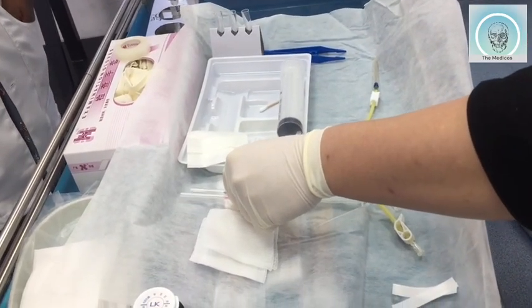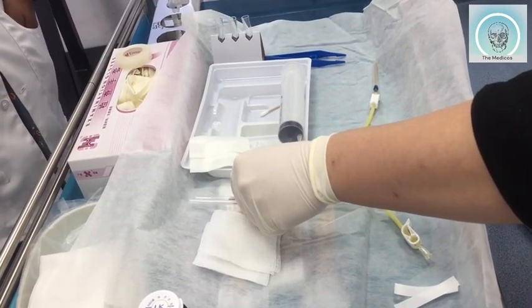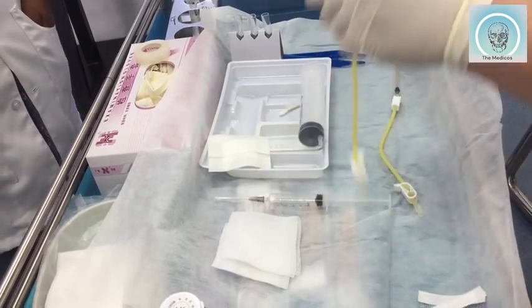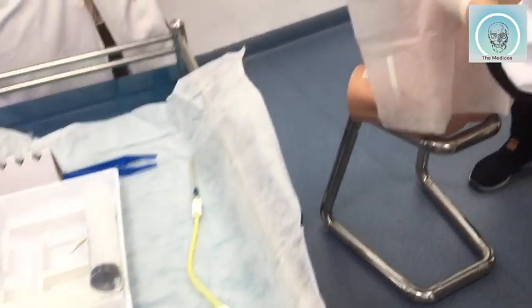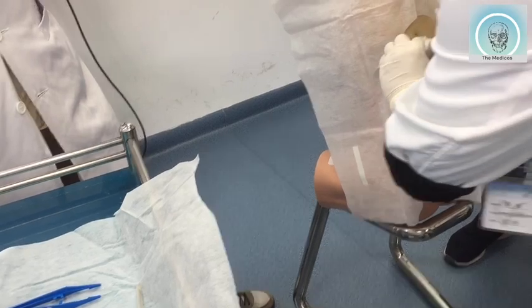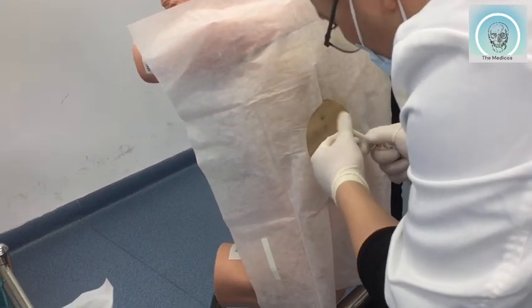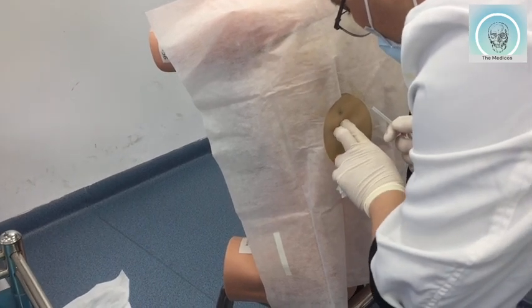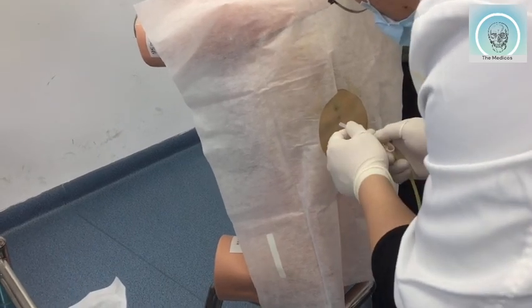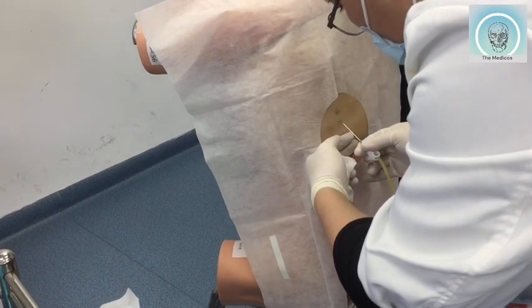First time you do with the small syringe, you use that for the local anesthesia and also for the first check of the depth of the chest cavity, the chest wall. Maybe for somebody very fat or somebody very thin, the depth is different. Okay, so then after making sure the spot is right, then we will use this kind of big needle to do the aspiration. That's the formal one, okay?